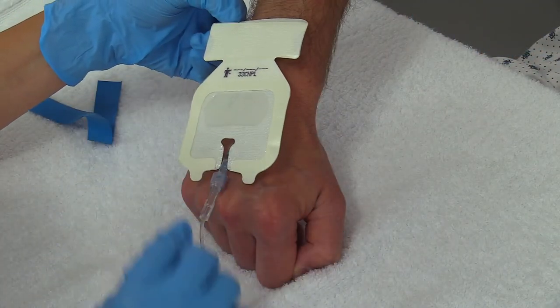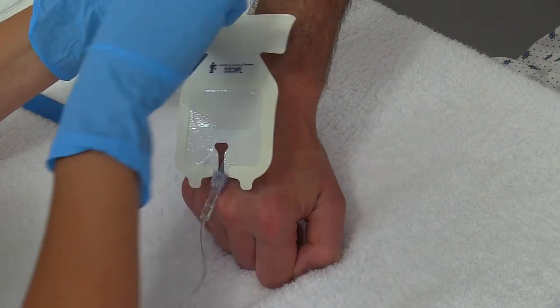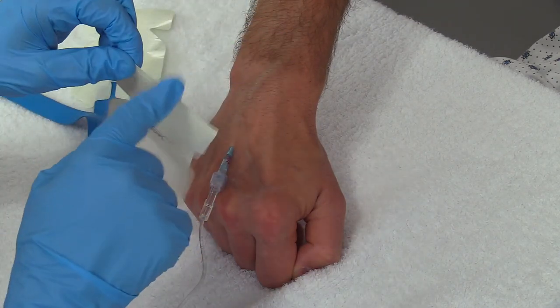With this particular dressing, you want to get familiar with your kits because everything's different. I'm going to take this part off like so, and I'm going to hold it at this end.